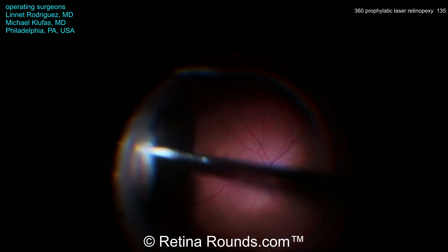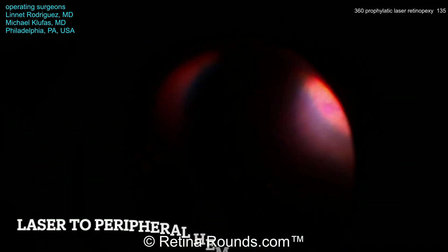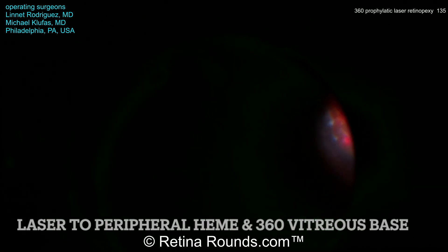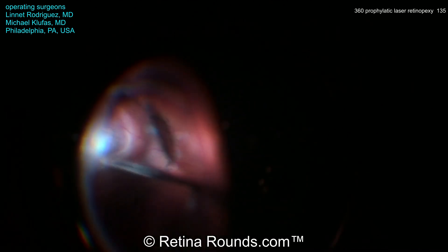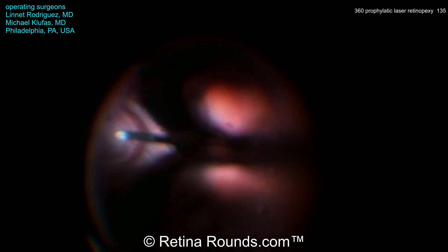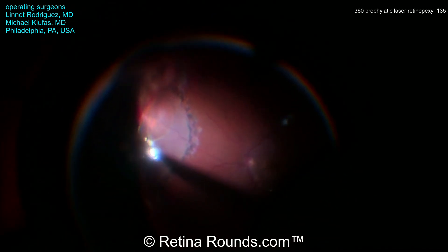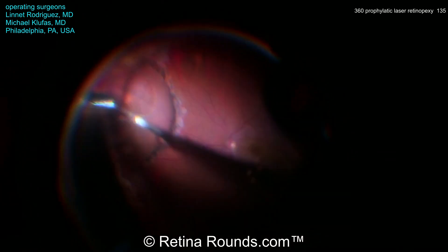This peripheral shave is a step that can help to decrease the risk for postoperative retinal breaks, since vitreous contraction — particularly at the vitreous base — may cause a new retinal break. Dr. Klufus and his fellow are shaving the peripheral vitreous and now tackling the area of peripheral retinal detachment that was previously lasered. This 360-degree peripheral prophylactic laser barricade is the main topic of today's video, applied all the way around 360 degrees in about two to three rows of confluent laser.